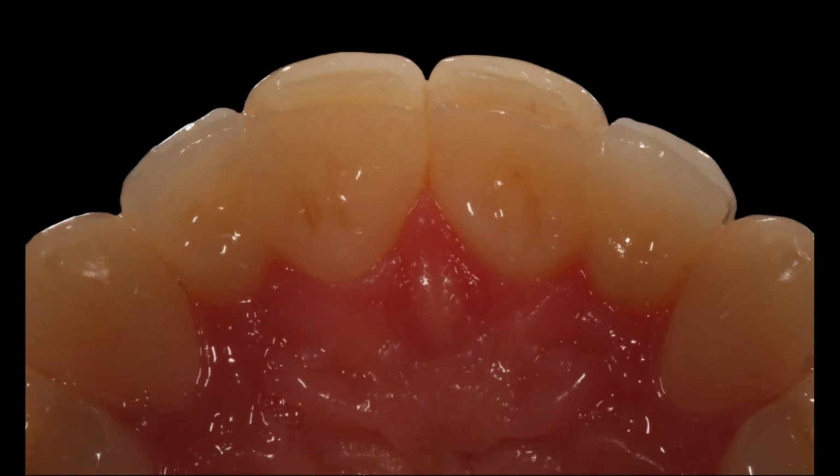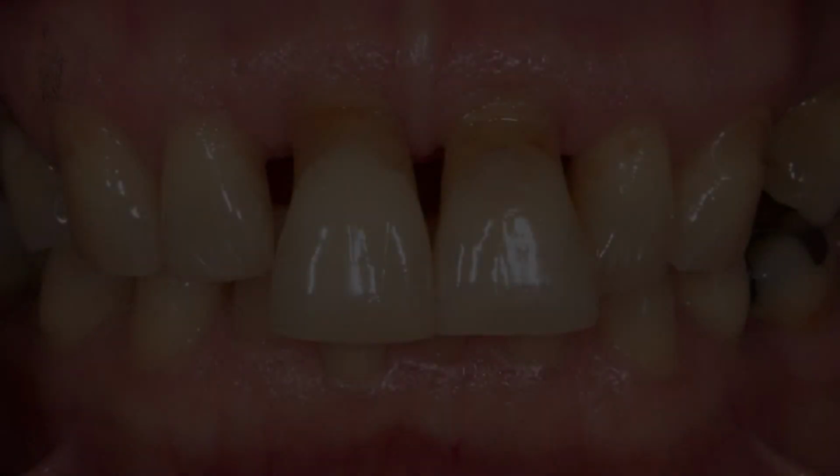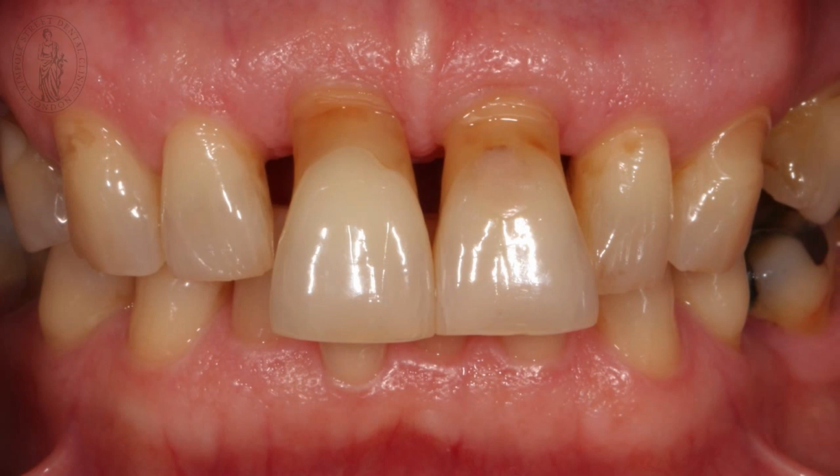Patient was as well. It blends in perfectly into the natural environment, and you can't really see that we've been there. Of course you can do bridges as well for the side teeth, Maryland bridges. So that means you don't have to drill too much away from the tooth. This is an experimental technique. There's no data for that, but my personal experience is that I have not seen one single bridge falling out, and we've done approximately 15 to 20 of those bridges for patients who didn't want to have implants.